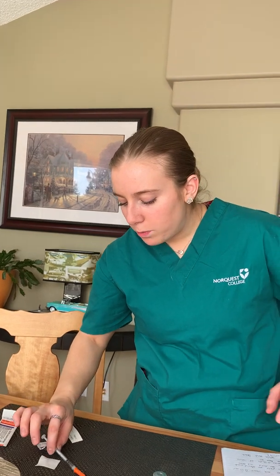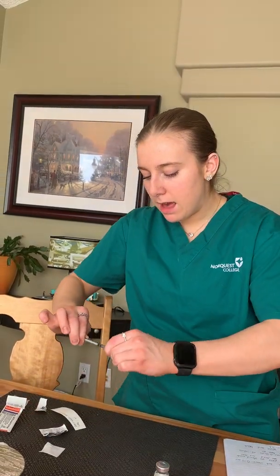I will then scoop up the lid or the cap, place it back on. We then want to make a label. So for this video, I've already made a label with the patient's name, the medication, the dose, the time, the route, and as well I have initialed it with my own initials.